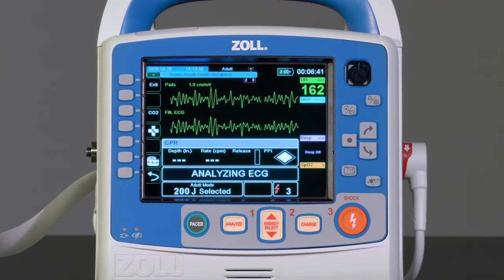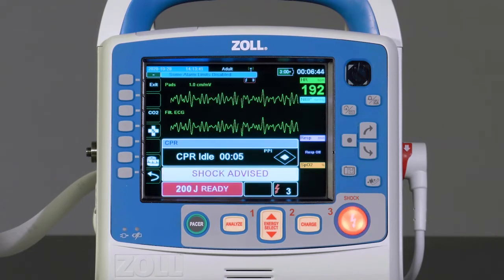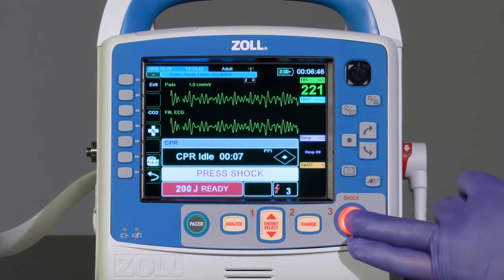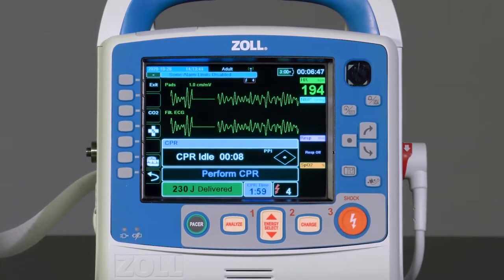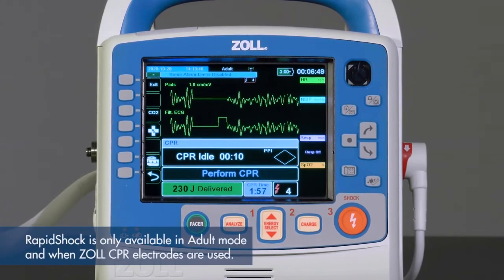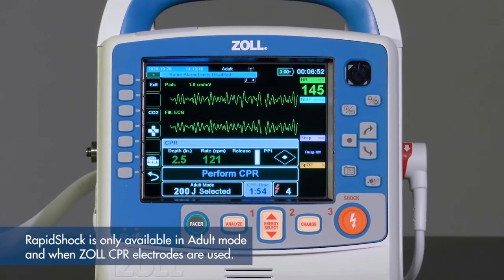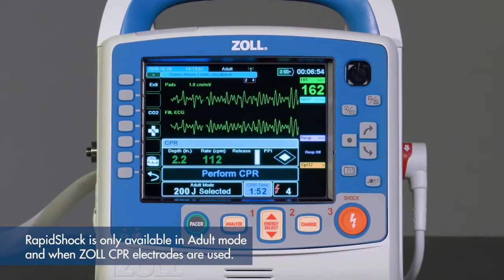The rapid shock analysis algorithm provides a rapid shock or no shock decision. Rapid shock is only available in adult mode and when Zoll CPR electrodes are used.